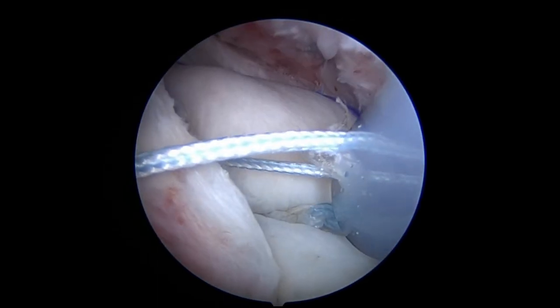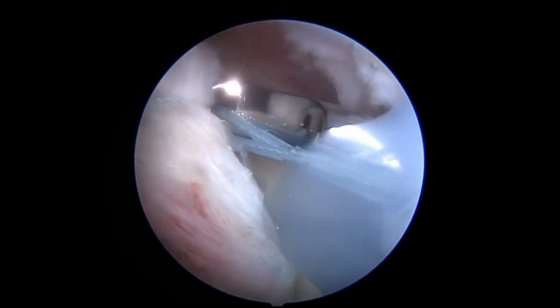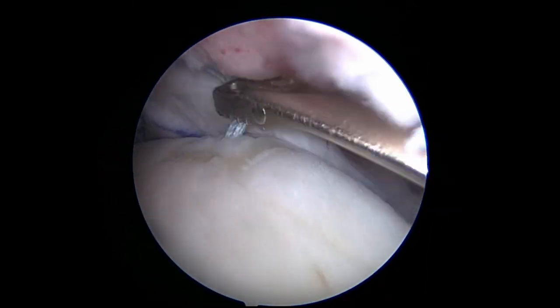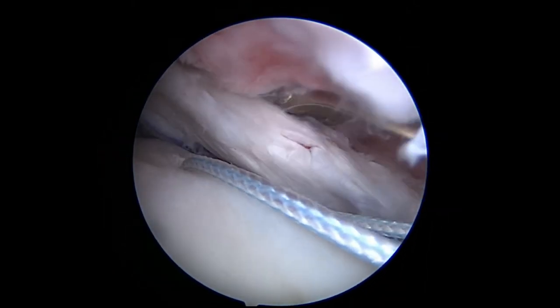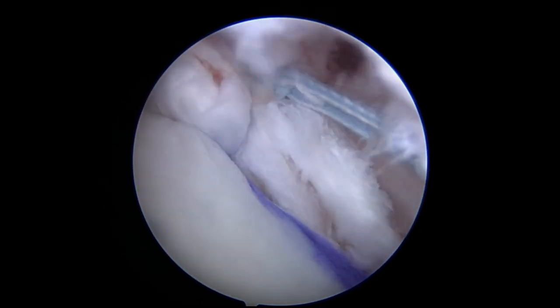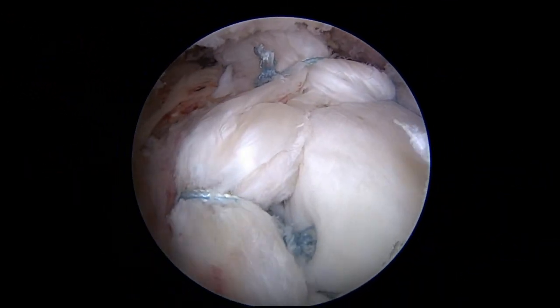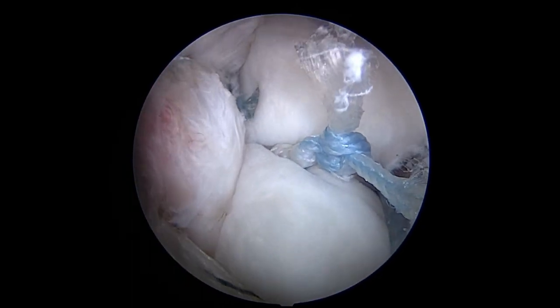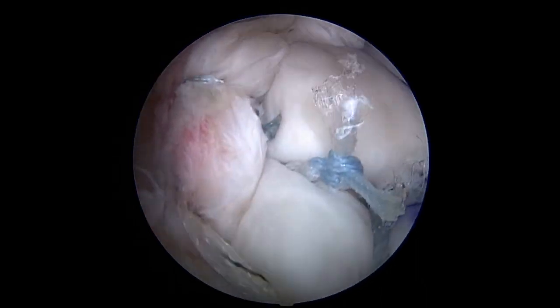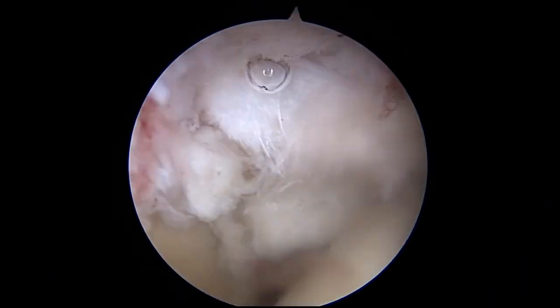A number two fiber wire suture is passed through the infraspinatus tendon and into the posterior margin of the graft and tied together for posterior margin convergence. Anteriorly, a scorpion suture passer is used to pass sutures through the graft and then through the anterior rotator interval tissue; the anterior margin convergence suture is then tied with the knot pusher. A medial margin convergence is then performed between the anterior tissues and the infraspinatus. This completes the superior capsular reconstruction with infraspinatus repair, as seen from the bursal side and from the articular side.